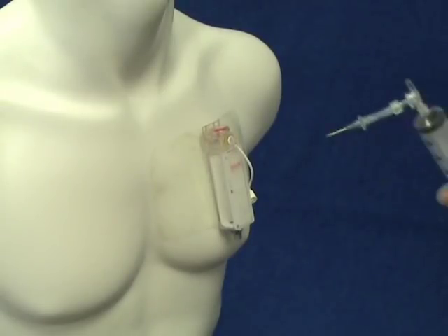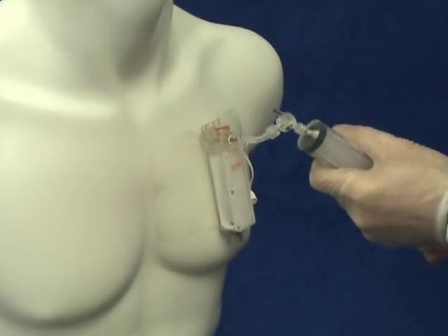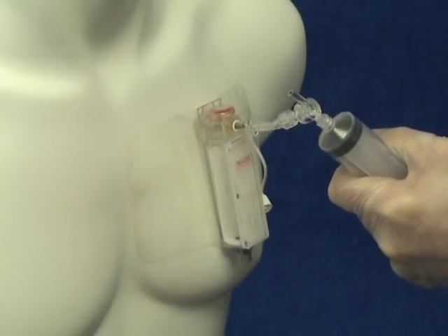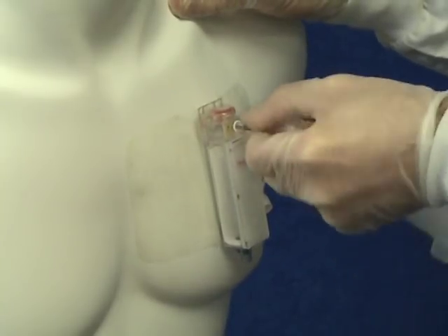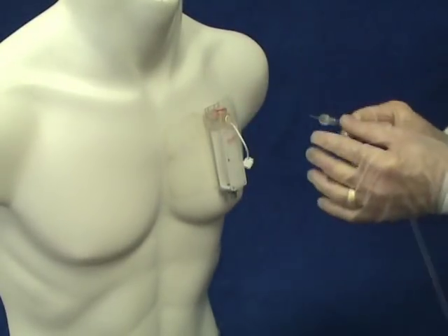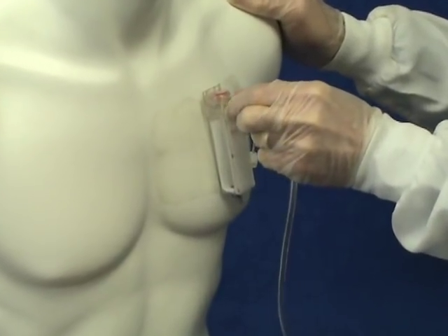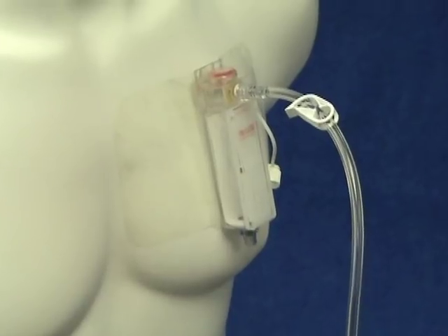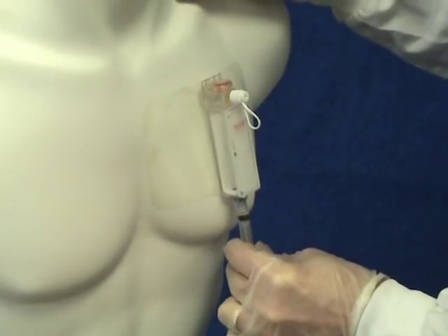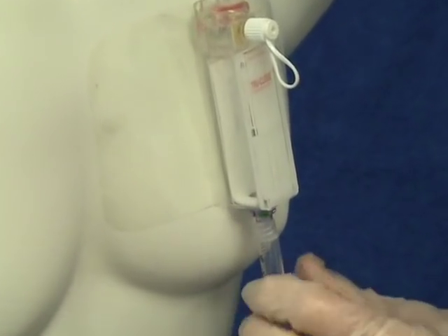A valved aspiration cannula is provided to allow manual air evacuation if desired. A suction tubing set is also provided for attachment to a water seal device or other suitable suction systems. The syringe-activated port at the bottom of the vent allows for the aspiration of small amounts of fluid that may collect during therapy.